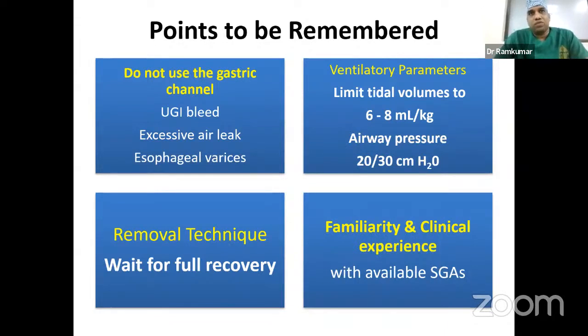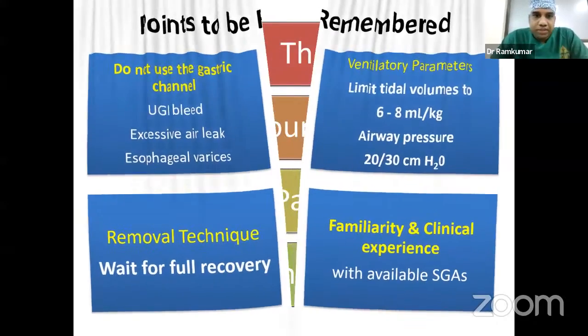It's not necessary to research and find each and every one and use one device for a particular surgery or a particular set of patients. Find out what is the best suitable device available in your area, get familiarized with it and gain enough clinical experience so you can use it accordingly, instead of searching for better devices.